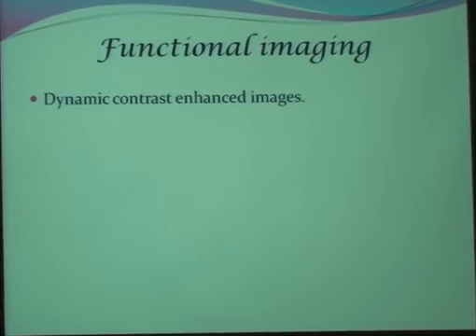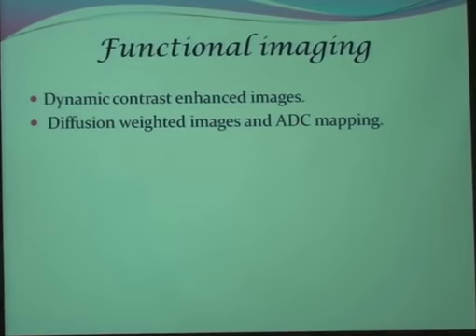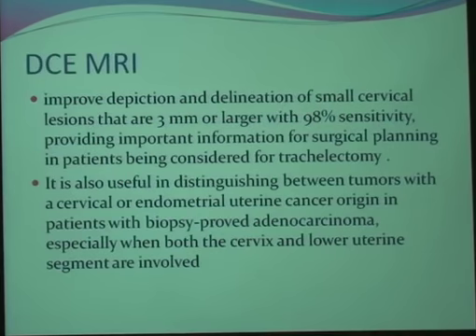Functional imaging includes dynamic contrast enhanced images, diffusion weighted images, ADC mapping and MRIs. They are not routine. Dynamic contrast enhanced MRI has three very important advantages.